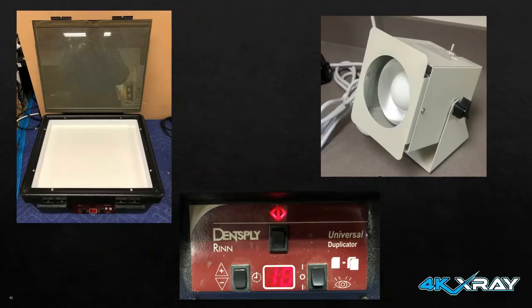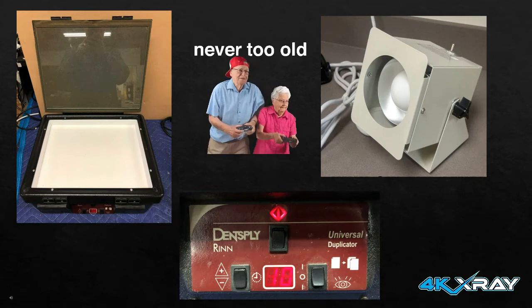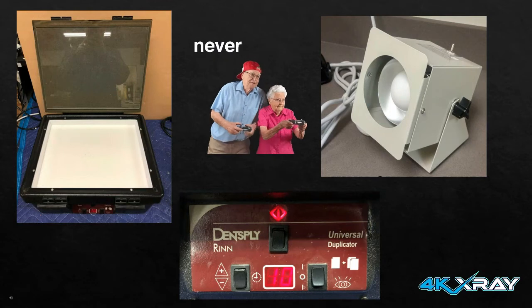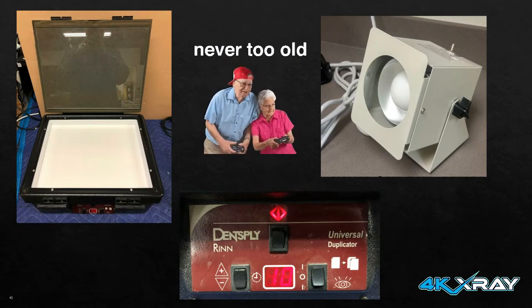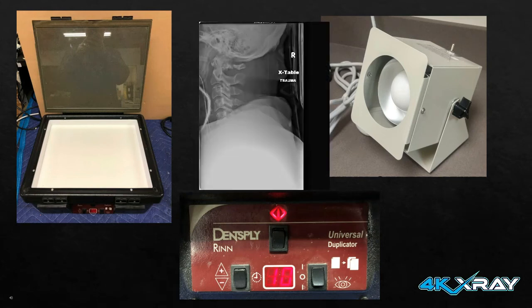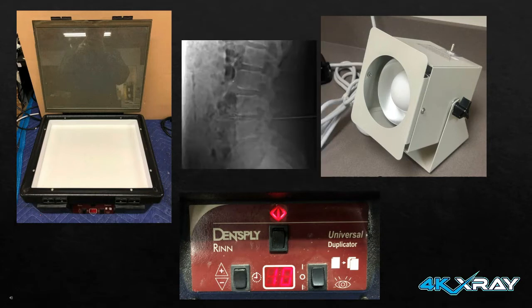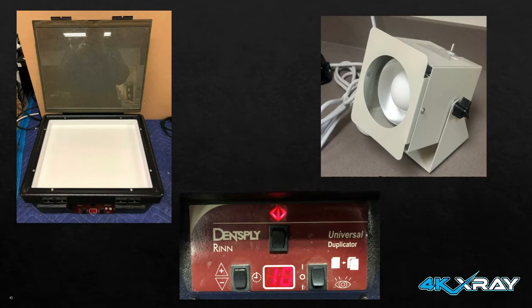Here on the top right, us old school techs remember what we call a hot light. This is the original window level, which controlled brightness for our overexposed films. I remember many times an emergency room physician using a hot light to see C7 to clear a collar, or a surgeon to see a needle placement from the OR. This was a way that we could make our images appear brighter than they originally were. Radiologists would also use this when they were reading and dictating the images.